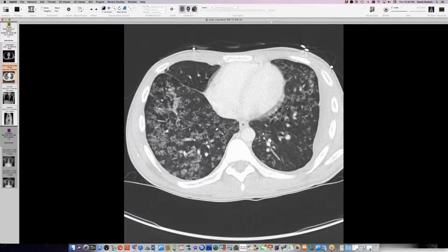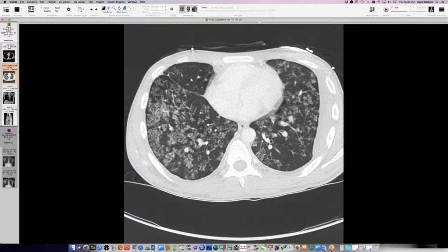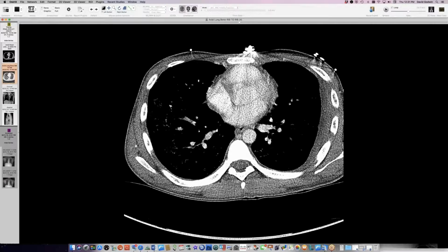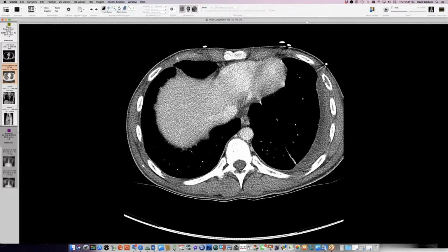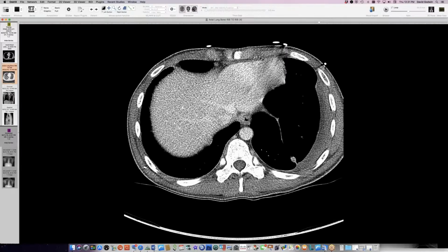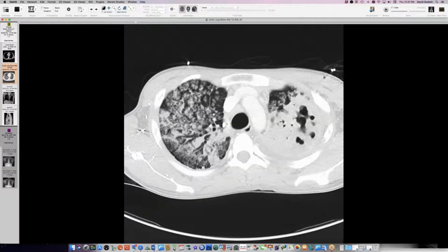Everybody's thinking about TB, given the history on this person. Trails off toward the bases, but this sort of acinar filling pattern all over the place. And then it appears that the left pleural process is very mature. It's probably left over from something long ago. This person had a history of travel to Indonesia 3 years ago with his sister. Wasn't in remote villages and things like that. People considered a variety of infections, and PCR came back late yesterday for tuberculosis.